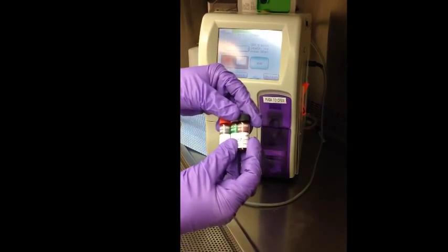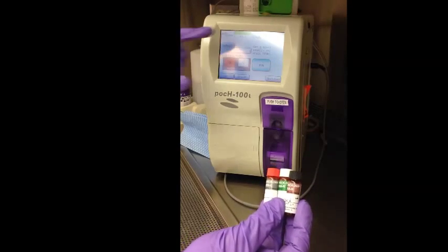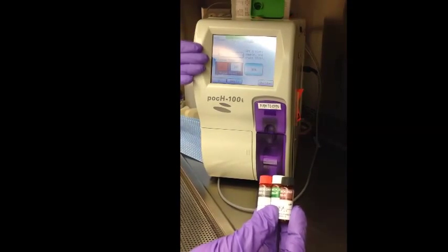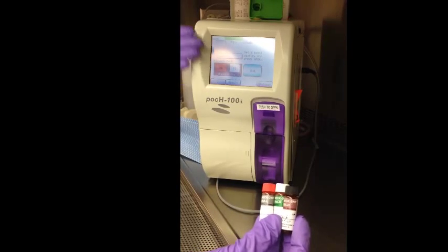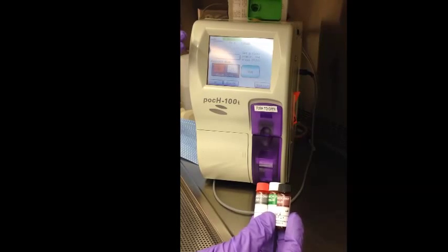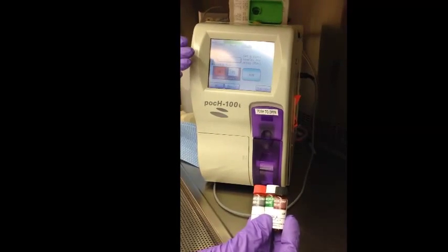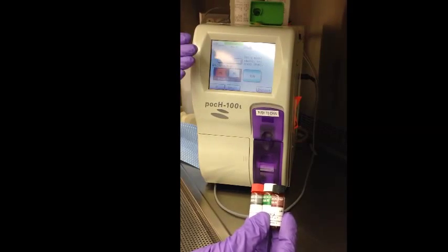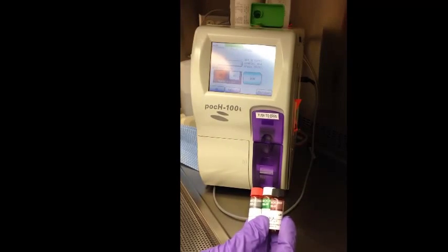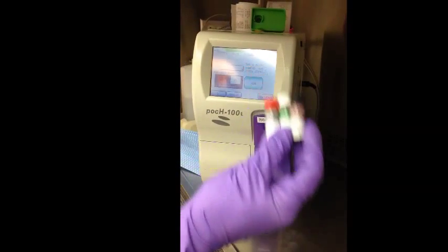So we're going to run the QC now that the analyzer has gone through all its checks. It's in ready status. Just by the fact that this base page main menu is here, it tells you that the background check has functioned. If there was a malfunction with the background check or some other process related error, it would be present here, and then you would have to work at figuring out what was the next step in that regard. So now we're going to run the QCs.